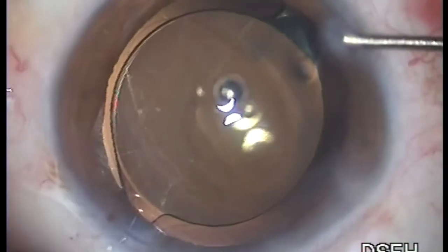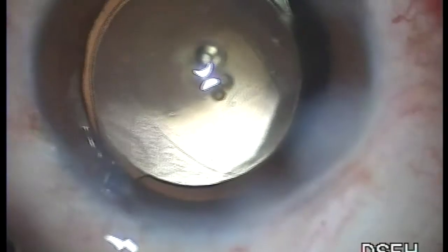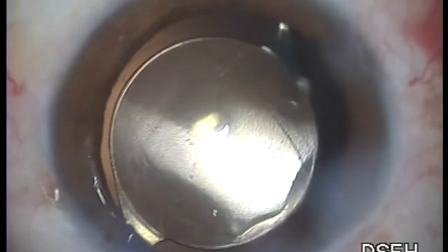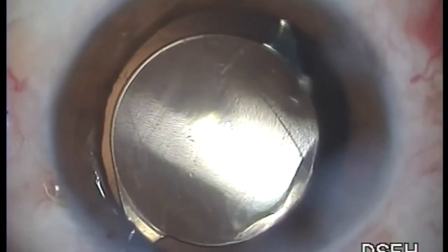A complication was produced during surgery but was managed beautifully. You can see the double capsulotomy.